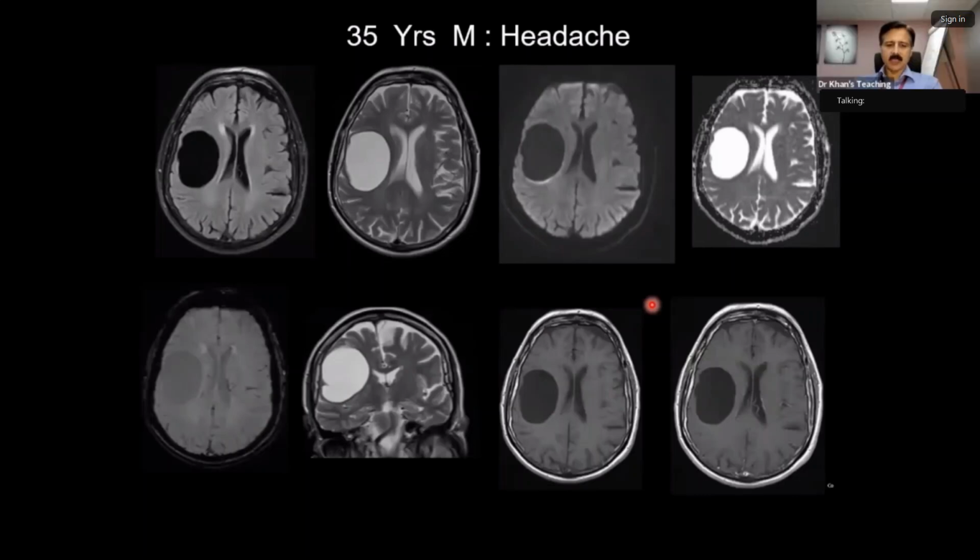A porencephalic cyst is a cyst in which there is basically a previous brain insult, such as infarction, surgery or trauma, etc. There was nothing like this in this case. Basically, this is the differential diagnosis of an intraparenchymal cyst. So your thinking is right, but I'm not satisfied because I knew the clinical history. So over to you.